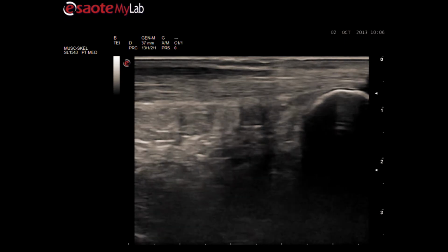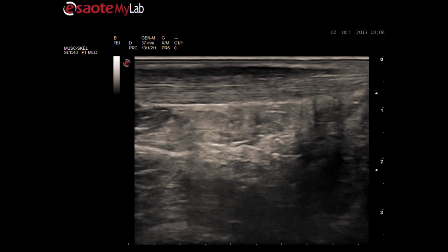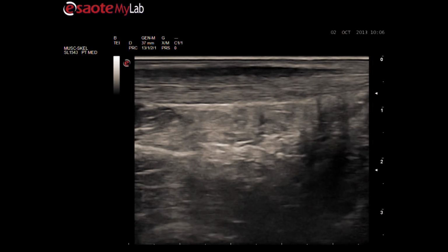Note the dark gray and black part in the superficial part of the tendon. This appears to be a zone with less quality, maybe even pathology. A healthy tendon always looks white or light gray. Black indicates an intratendinous swelling.